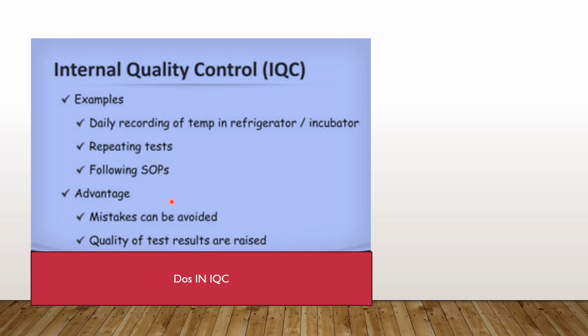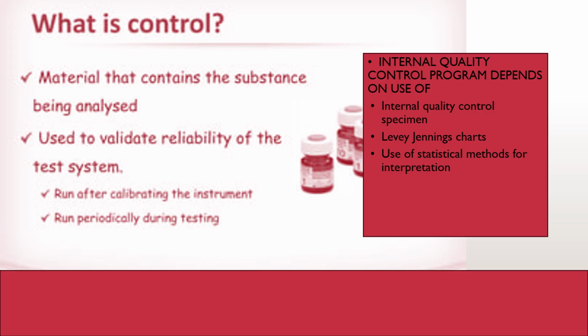Then advantages. What are the advantages of this internal quality control program? So mistakes can be avoided, errors can be immediately checked and we can rule them out. Then the quality of test results is definitely raised.